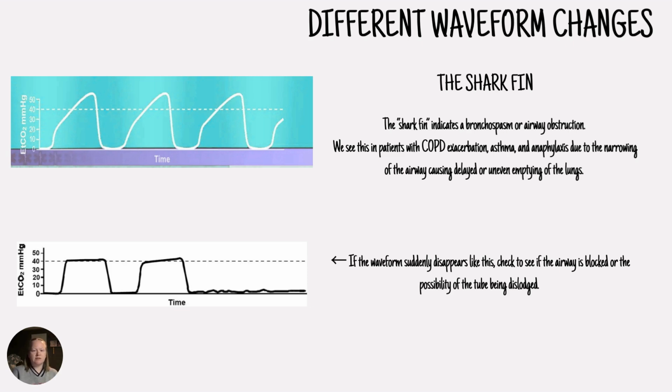If the waveform suddenly disappears, this is what I was talking about earlier, where the airway might be blocked, causing apnea, or maybe the tube is dislodged, so we need to look at it.